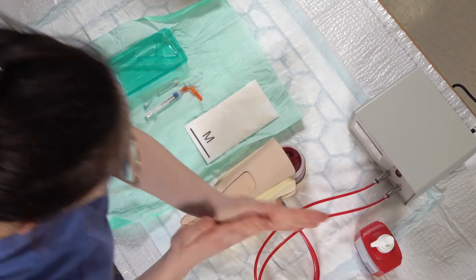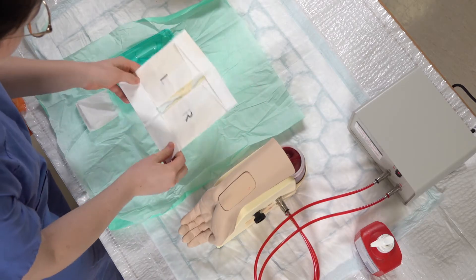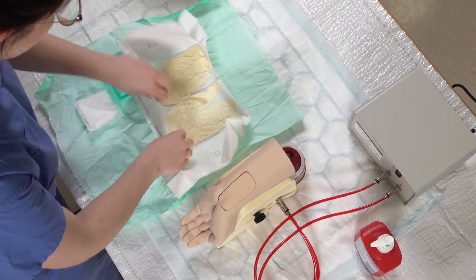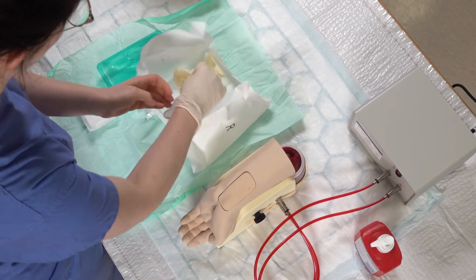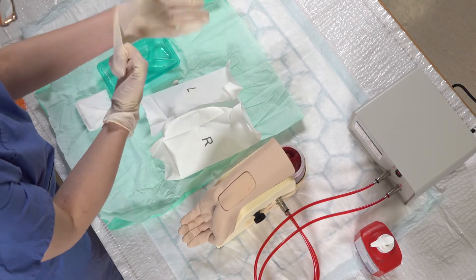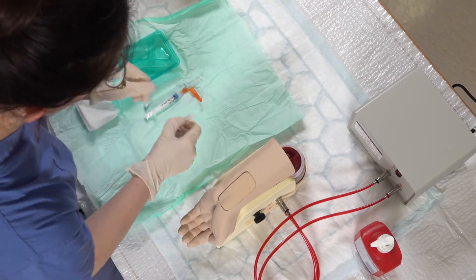I'm going to wash my hands again with the alcohol gel and then put my sterile gloves on. Okay, so I've got my gloves on.